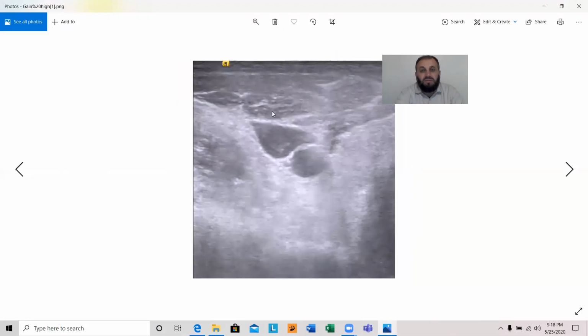If you look at this image, this is too much brighter. So it's a tech error or a doctor's error because the image is too bright. If it's this bright, we make a calcification. We make a false positive pathology. And also we cannot make it too dark because we can hide a pathology. So we have to play between, not too dark, not too bright.